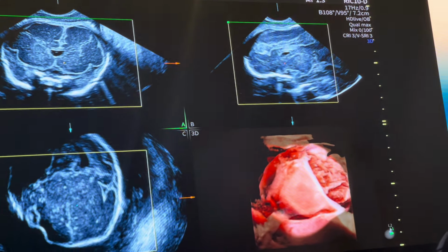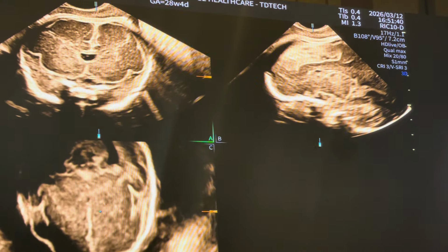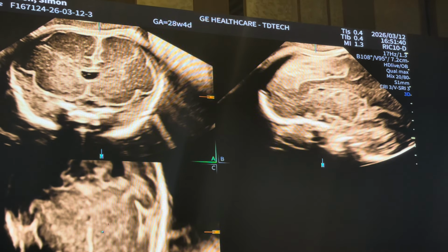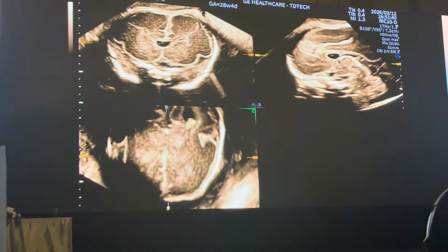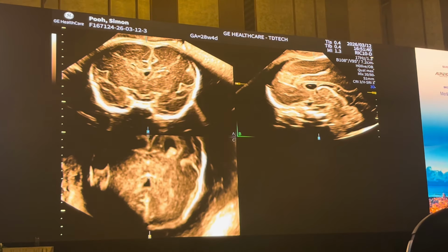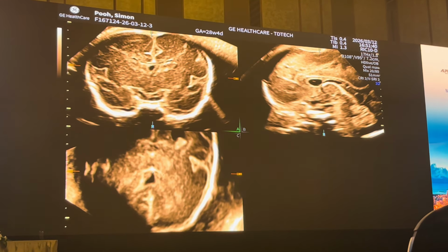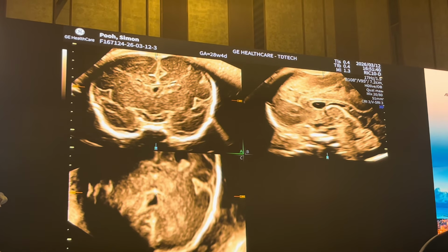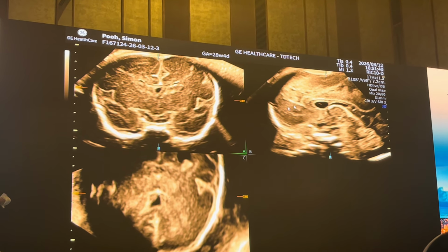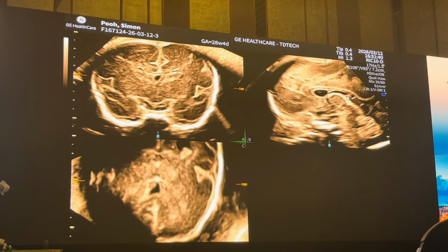Super. Okay. So we save that before we lose it. And now watch Ritsuko do her magic. So we go to multiplanar, place the reference dot in the cavum septum pellucidum. The plane shows the CSP. It's translating through the volume on the A plane. If you look at this volume and the planes A, B, C, most probably many of you are thinking about the thin corpus callosum, and it might be shorter than normal.